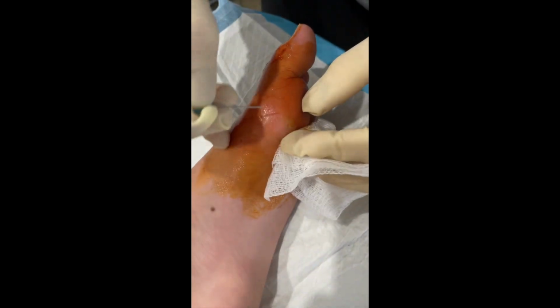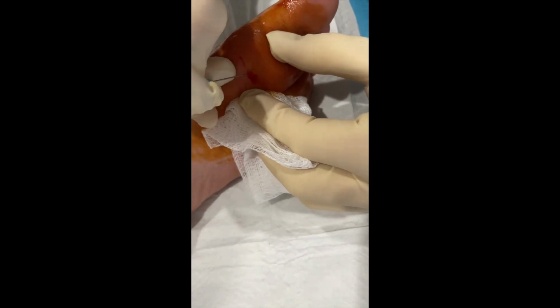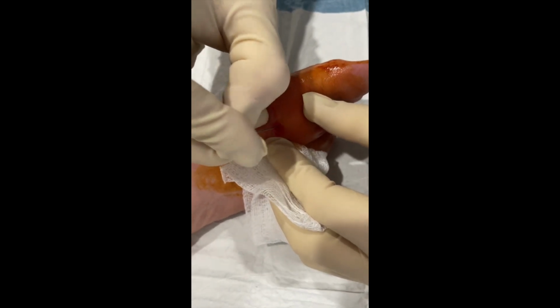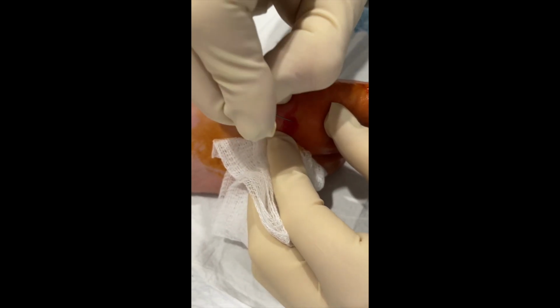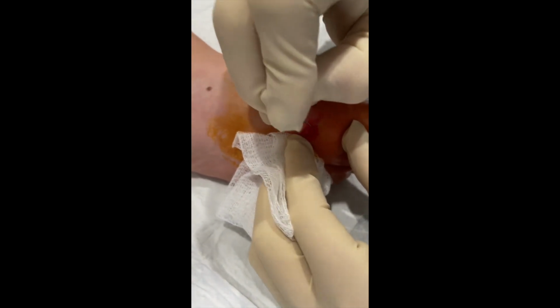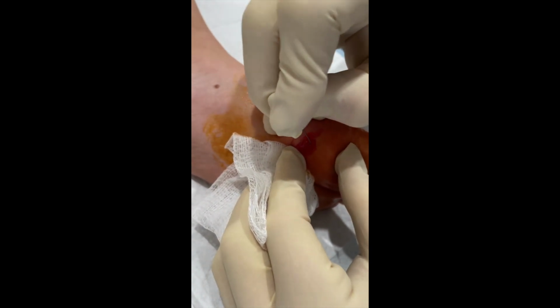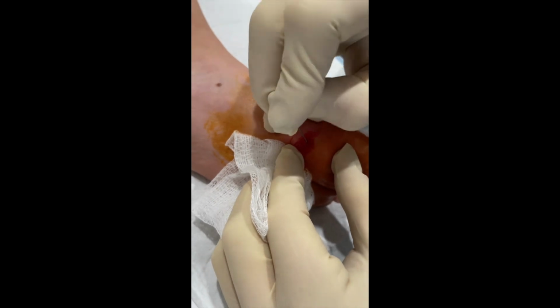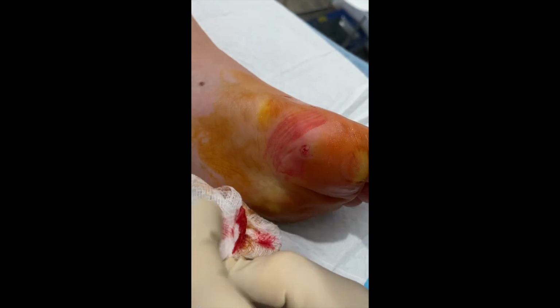Now that we're all set up, I start off by needling the verruca. And what this does is it breaks up all of the top surface and breaks up the verruca or plantar wart, so that when we do come to scoop it out and bring it out, it comes out a lot easier. Otherwise, it tends to be a little bit more difficult to try and break through the top surfaces of the skin.